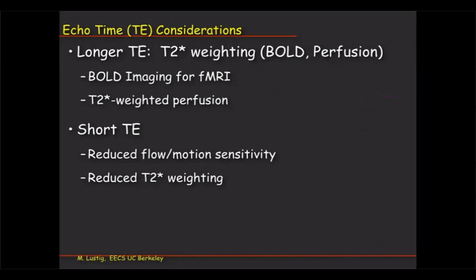Okay. The other consideration that we have for echo time, and it's also one of the options that you'll see on MRI scanners that is very, very common.